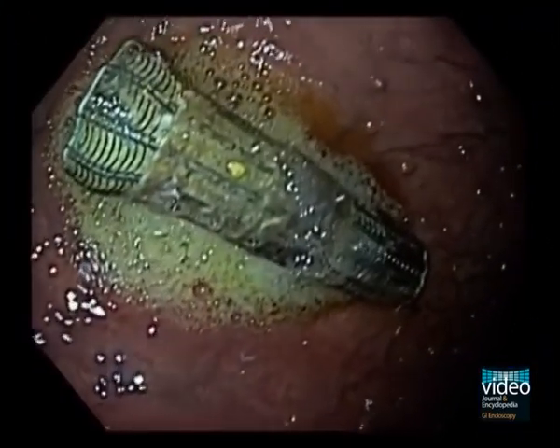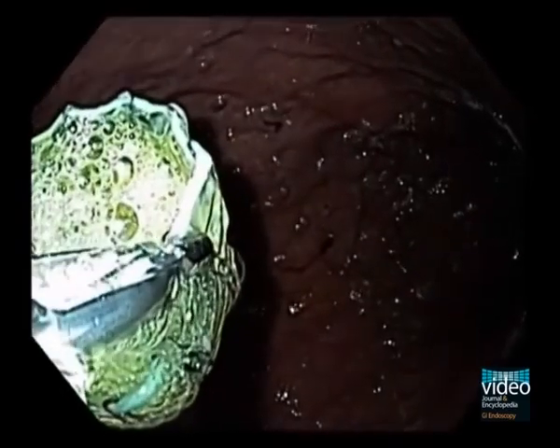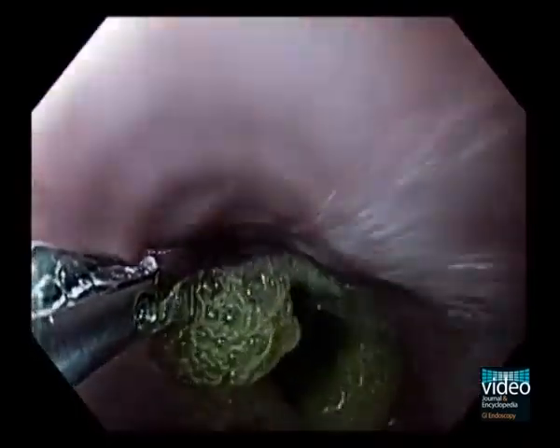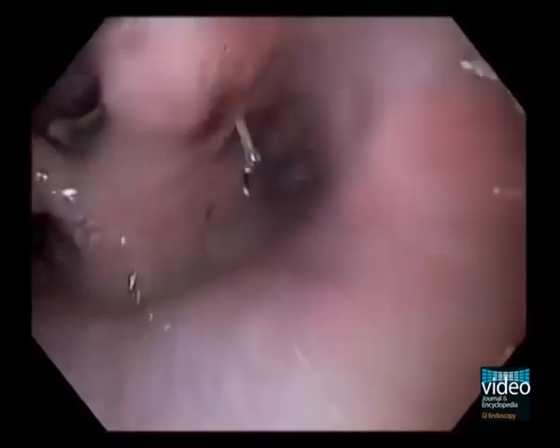This video illustrates complete migration of an esophageal stent into the gastric cardia. The stent is grasped by rat tooth forceps around the proximal retrieval string if possible, then withdrawn through the tumour and the esophagus. When the endoscope is removed from the patient, the stent comes off the rat tooth forceps. The rat tooth forceps are withdrawn back into the endoscope and the patient is re-intubated. The stent is located just below the level of the upper esophageal sphincter. The endoscope passes into the proximal esophagus, the stent is grasped again with the rat tooth forceps by the retrieval string, and removed from the patient.